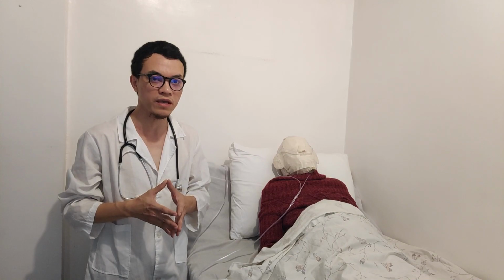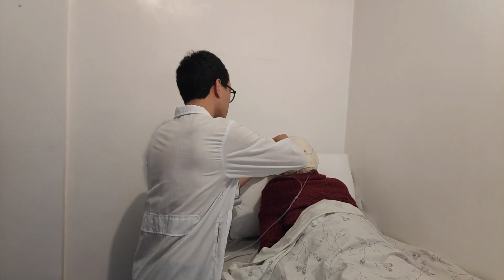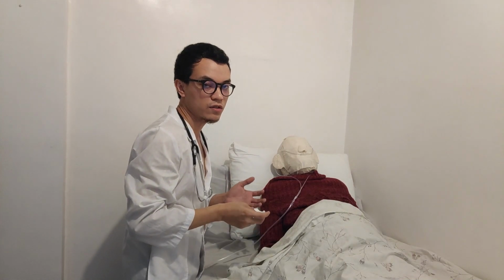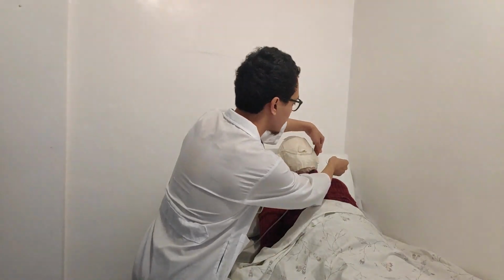And then don't forget to place a gauze pad beneath the ear, beneath the tubing, as necessary. Placing a gauze pad will prevent irritation to the patient's skin, especially if the tubing will rest on the patient's skin for a long period of time.